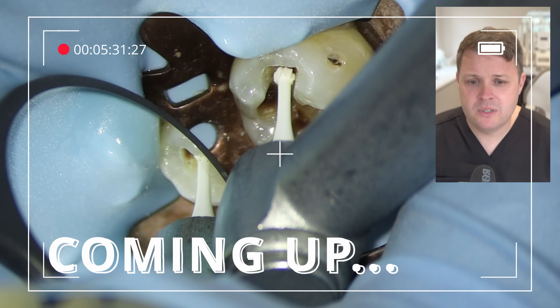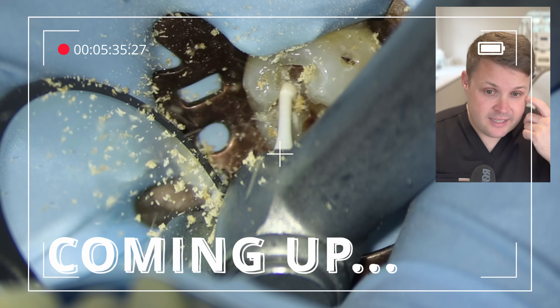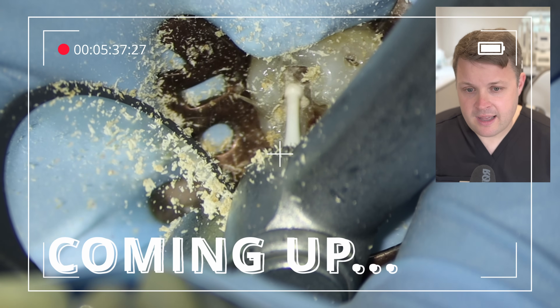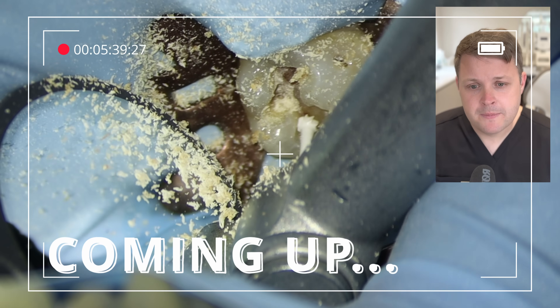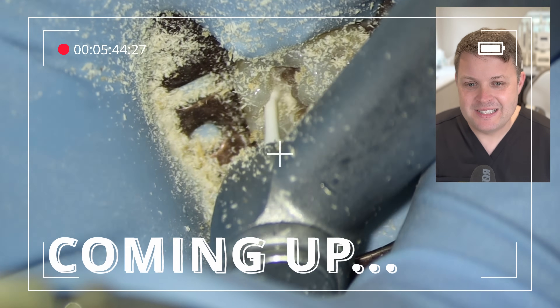The great thing about these ceramic burrs is that they have great cutting efficiency, but they don't vibrate the patient's head into next week.